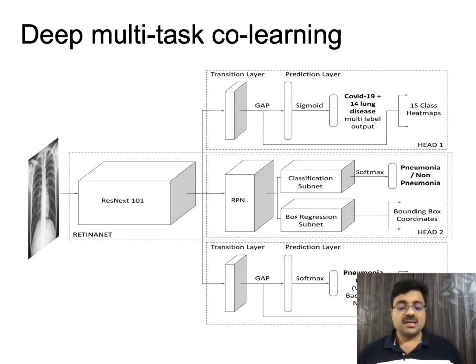Relying on existing state-of-the-art like RetinaNet, right, it naturally made a huge difference in terms of being able to quickly come up with an effective and accurate solution, while allowing us more time to solve for the vagaries that were specific to our situation, such as the lack of enough training data or having to solve for low-quality images.